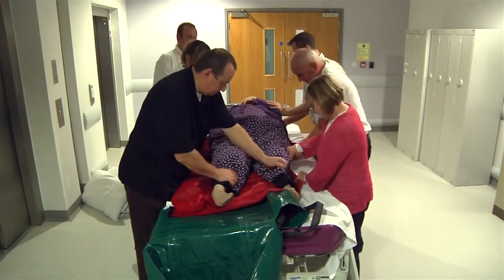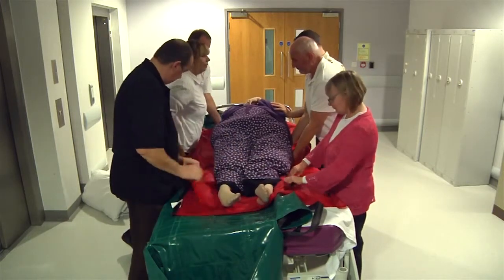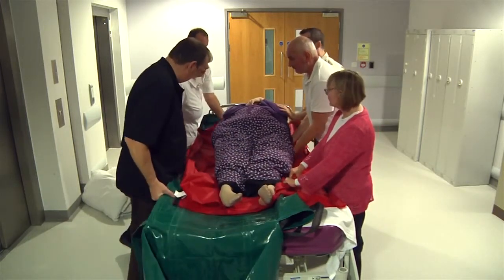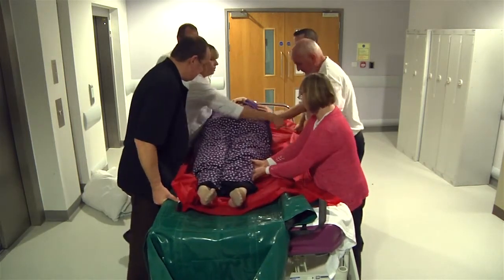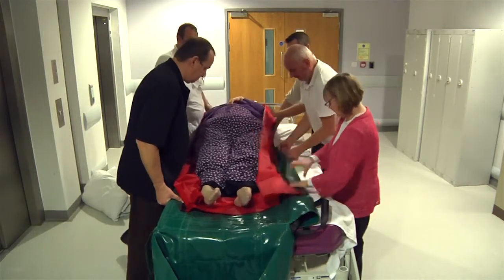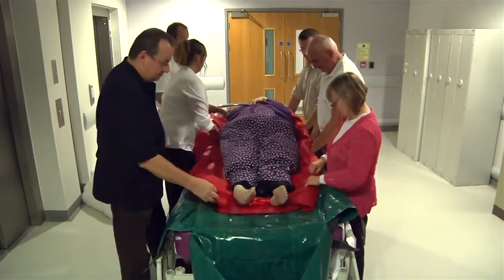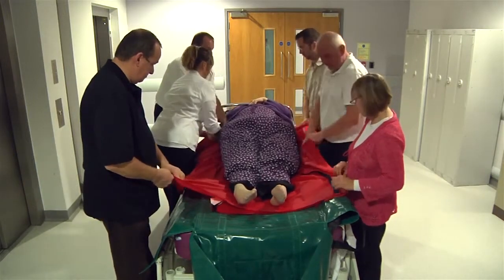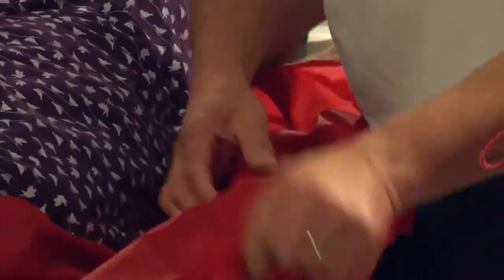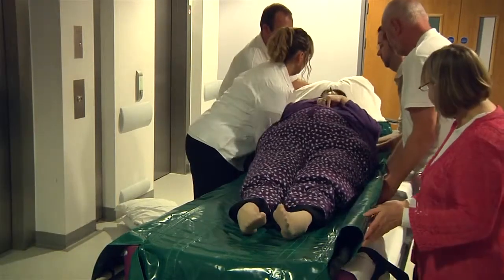Position the patient centrally onto the evac mat, ensuring that the head is placed on the area marked 'head' before commencing the buckling process. Make the patient as comfortable as possible by reassuring and explaining the process throughout.